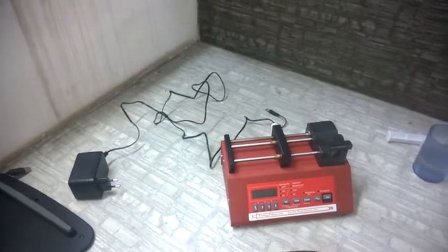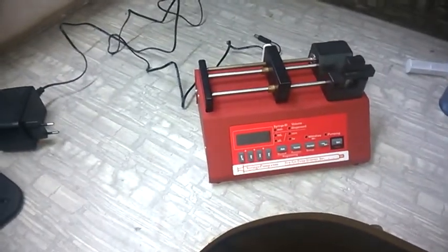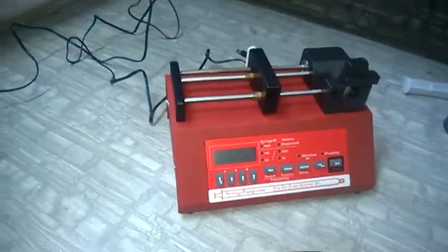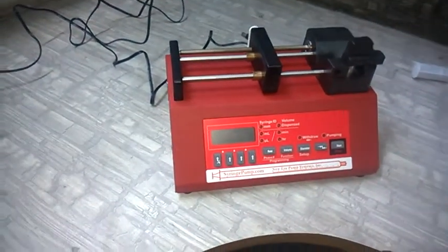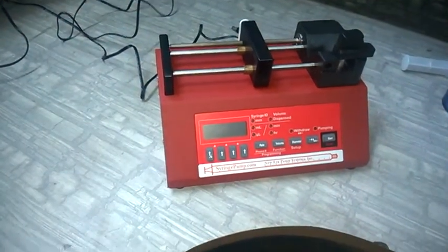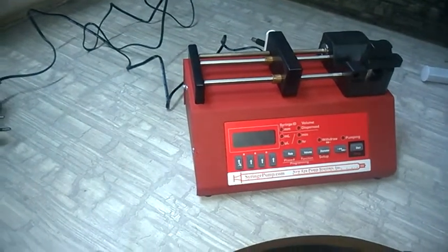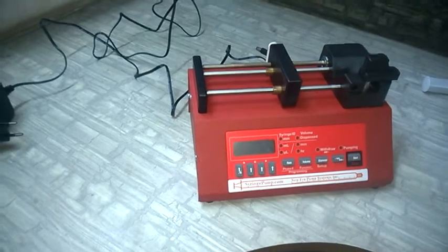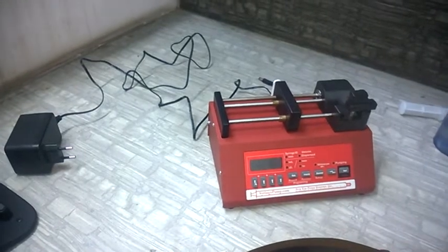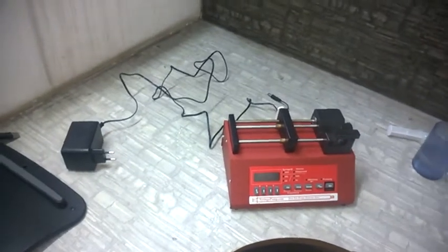Dear customer, we thank you for purchasing the new era syringe pump. This model is the NE300 from New Era Syringe Pump USA. This machine is a very simple, almost plug-and-play machine. Still, we are preparing this video so that it becomes easy for you to run it. This machine can only infuse — it cannot withdraw — and we cannot do any programming, meaning we have to stop it manually.